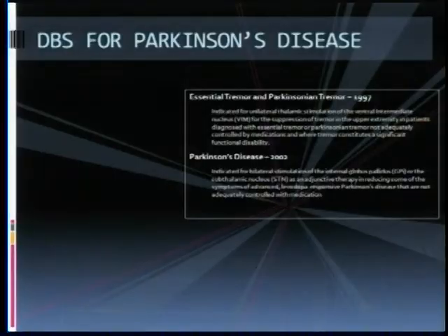A lot of times Parkinson's patients come into me and they talk about DBS and how new it is and what a new treatment. And I put this slide up to point out it's actually been around and FDA approved for a number of years. We started in Spokane actually under research protocol implanting the STN back in 2000, and that's right when I joined the team. And so we've actually been doing it for a number of years, so I just wanted to highlight that.